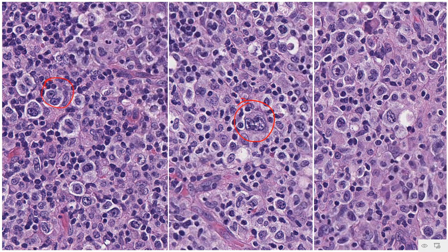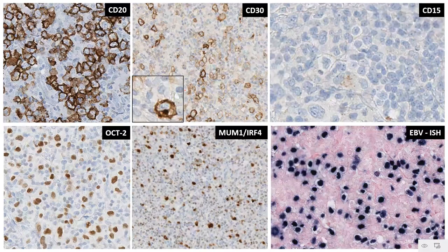So, of course, the EBV-associated DLBCL is thus a strong histological mimic of a nodular sclerosis Hodgkin lymphoma of the syncytial variant. But the IHC should help you a lot, right? Because these cells are DLBCL, they will express a strong positivity for most of the mature B-cell markers like CD20, CD19, CD79A, OCT2, BOB1, etc. These are also strongly positive for CD30 and express the CD30 in the same fashion as you see in the case of classic Hodgkin lymphoma.